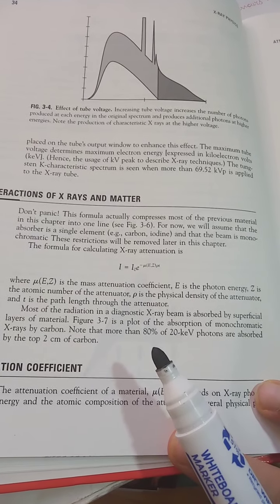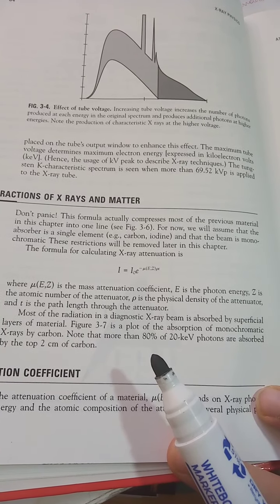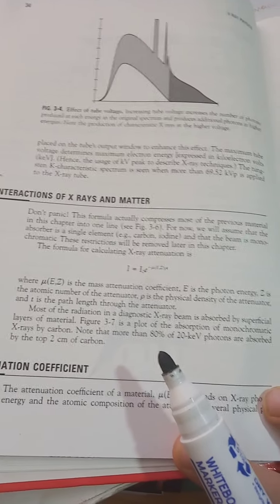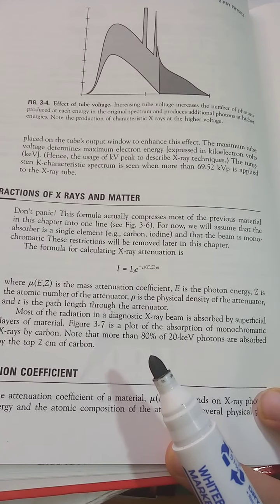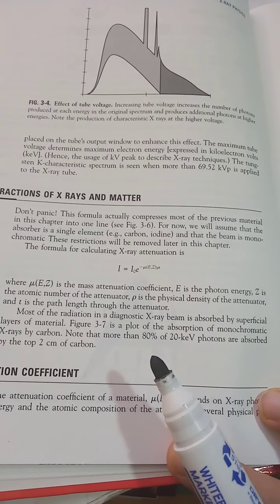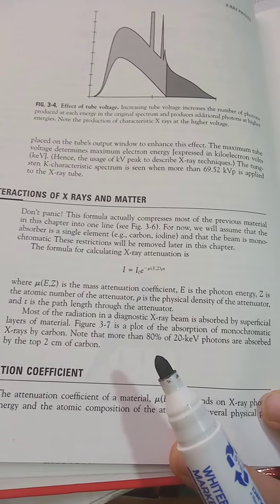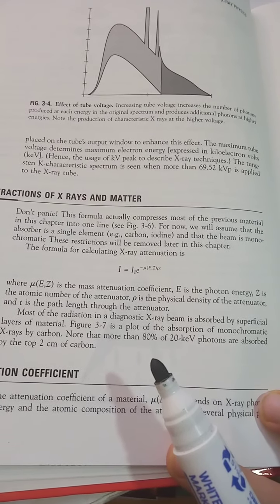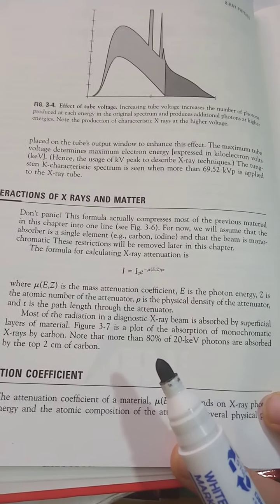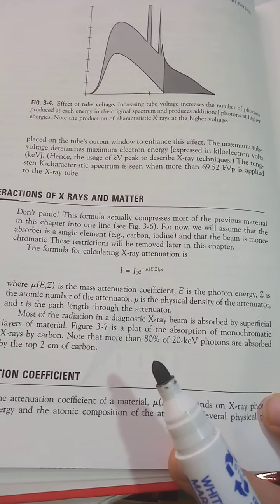Mu is the mass attenuation coefficient, it's constant. E is the photon energy, Z is the atomic number, not the nucleon number, but the atomic number, the bottom one. Rho is the physical density of the attenuator, not the element, but the attenuator, be it tungsten, osmium, or molybdenum, and t is the path length through the attenuator, not the time, but the path length.